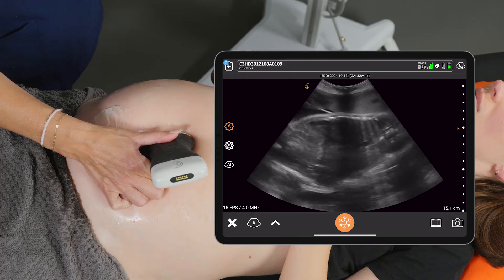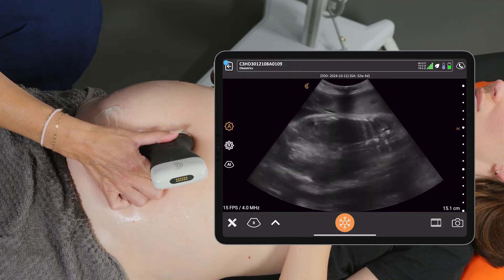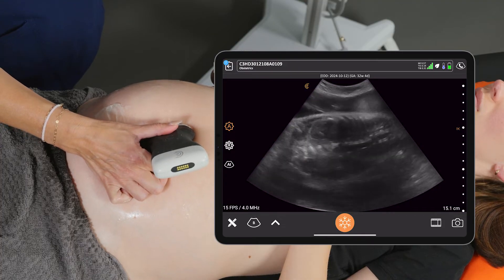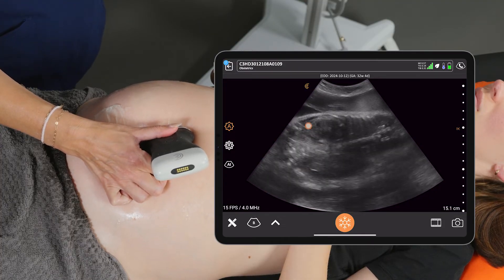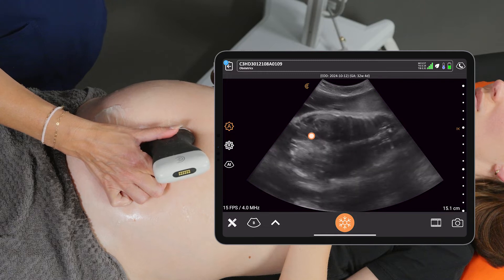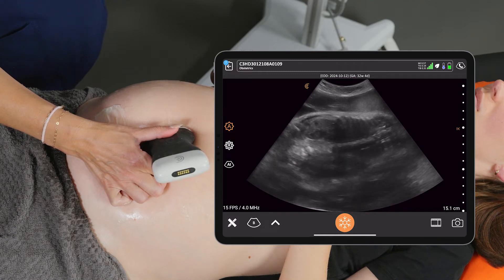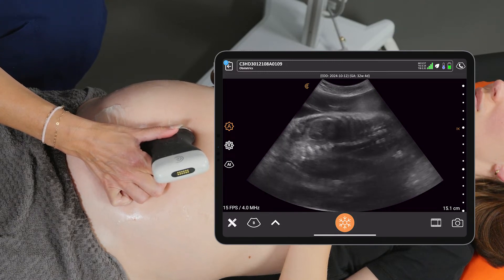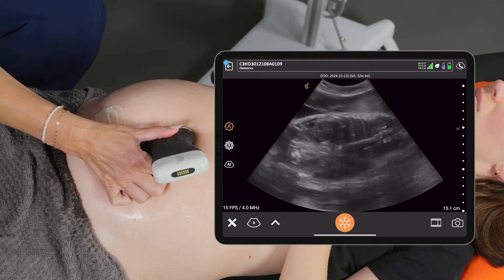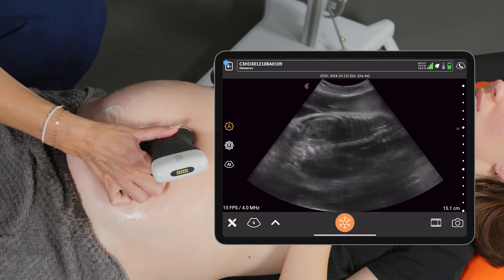If we scan a little bit more posterior, we can see the baby's kidneys come into view, and we can see the kidneys moving up and down with the diaphragm as the baby practices that breathing motion.